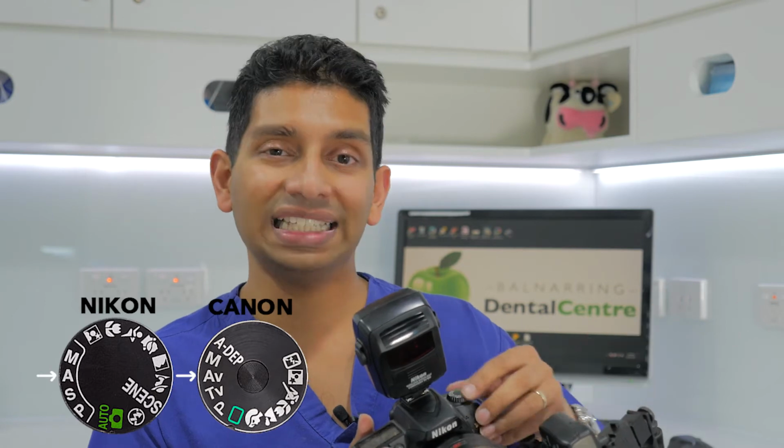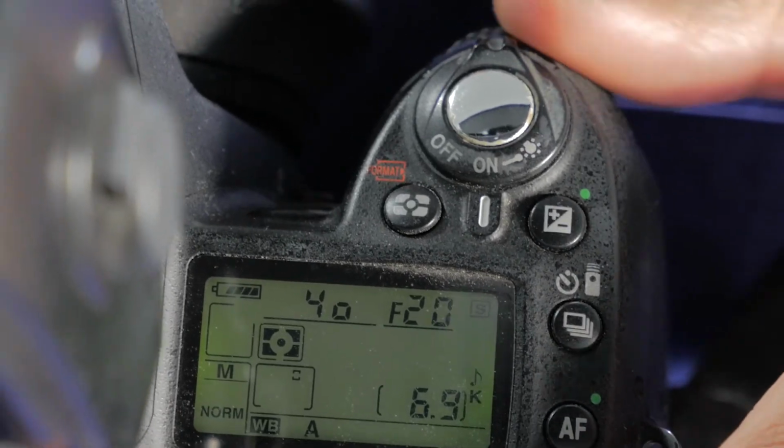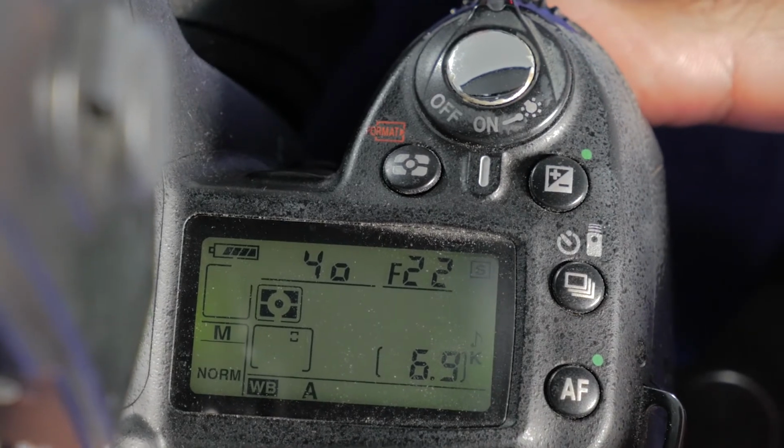No matter which camera you have, they're going to have an Aperture Priority symbol. For my camera, which is a Nikon, it's an A. Click it to A, and you're going to have a wheel somewhere in the camera, which you're going to be able to set that Aperture Priority to. Now, as you roll it, it'll go all the way down and all the way up. Now, for an SLR camera, if you remember from my last video, you want to set it to 22. So you set it to 22, and then you're good to go.